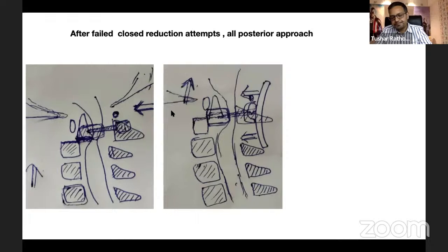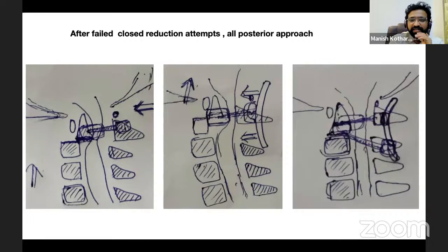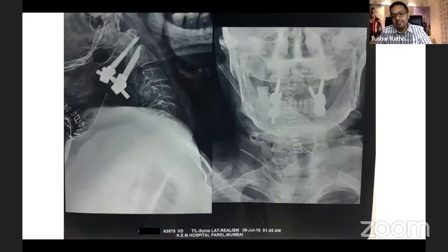Okay. Great case, Dr. Tushar. Very interesting to see the CT images. I was almost expecting this to half self-reduce under anesthesia. But believe me, it really took time and we were also concerned about the spinal cord. Since the right side vertebral artery was kind of rudimentary, I was very aggressive on the right side. I exposed both facets, and since the C1-C2 facet capsule was already damaged, I could pass my Penfield between them and then reduced it gradually. Very innovative approach. Thank you.